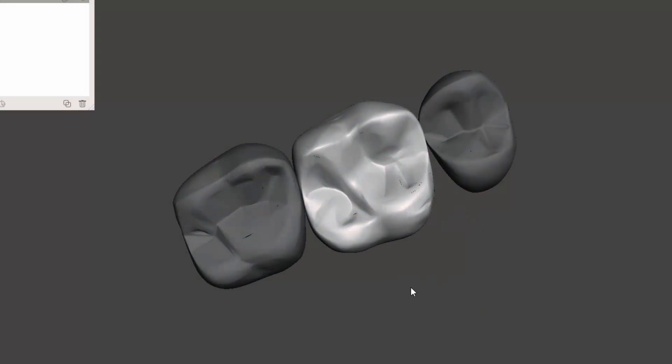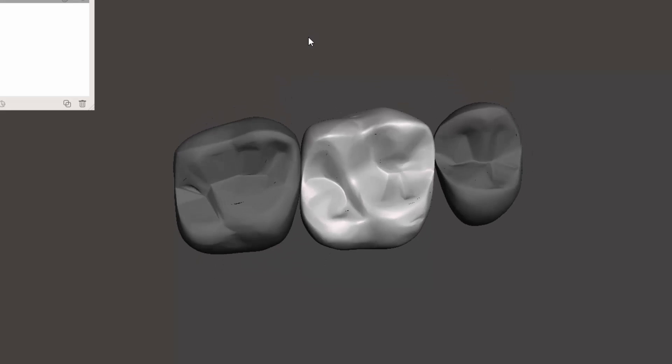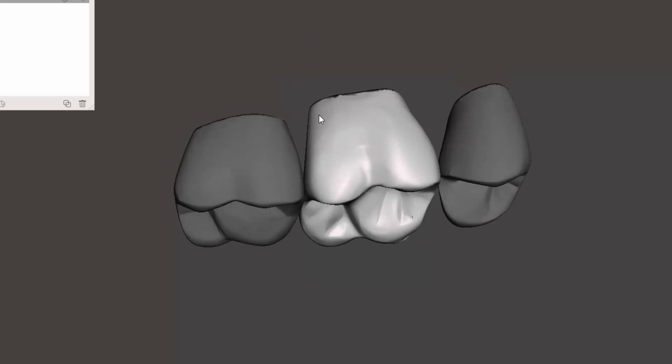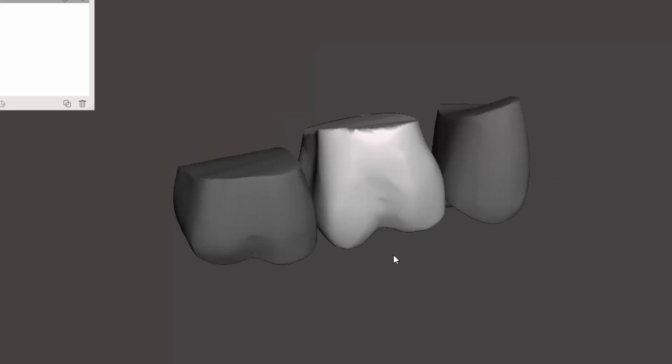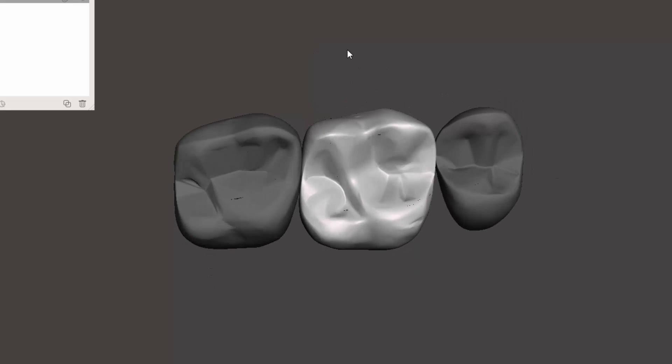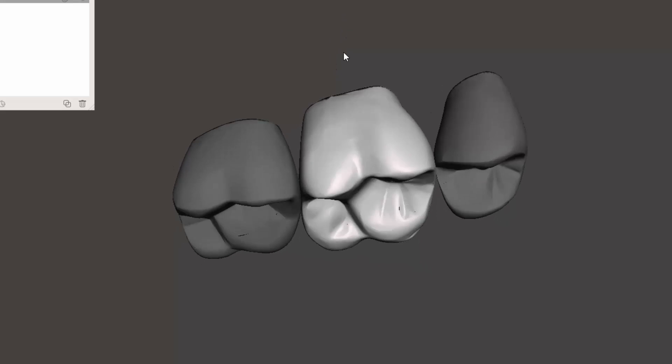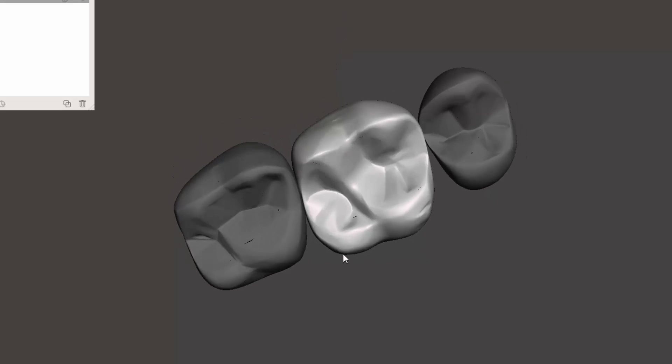Alright, here's a quick video using the exported teeth from Blue Sky Plan. The better tertiary anatomy teeth that people are creating themselves are excellent and they'll be even better for this purpose, but for now this should be a pretty simple example.